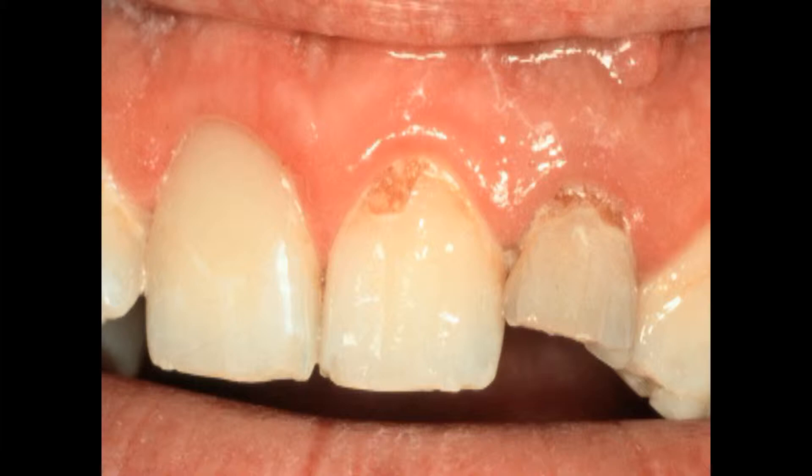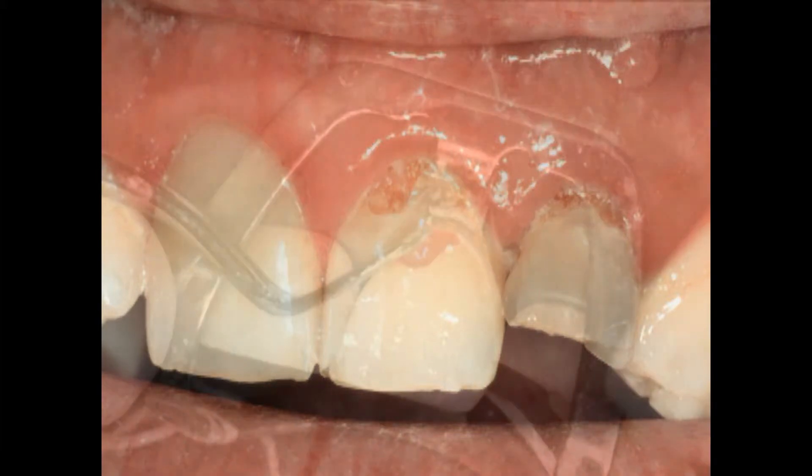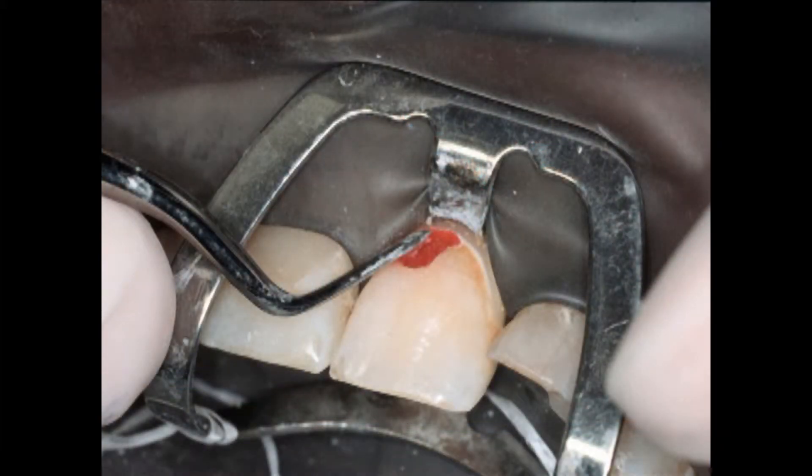Here we got caries going underneath the gingiva. Anesthetize the patient. I'm filling this in with red wax. I hope you get a feeling for how easy this is — you've probably never done it, but it's easy just to fill that defect up with red wax, burnish it with any instrument. Red wax burnishes very easily, much easier to work with than composite. So if I have any contouring that I want to do, I'd rather do it in red wax.